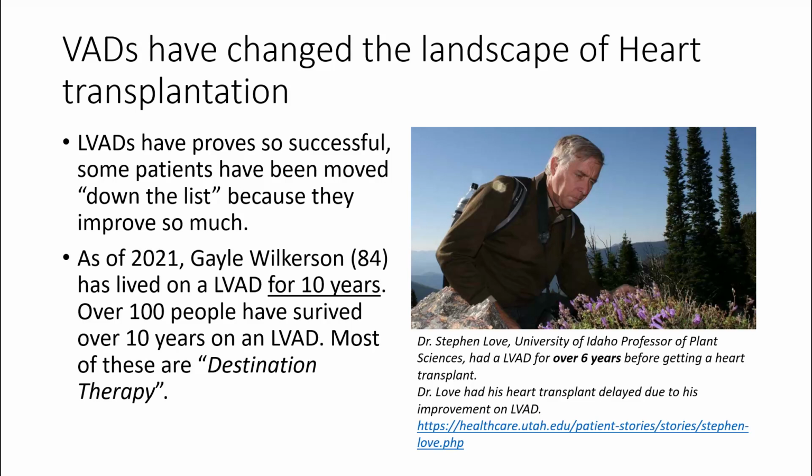As I said, some of these patients can live on an LVAD for over 10 years. Generally, so far there's been over 100 people, which is a small percentage compared to, I want to say there's 60 or 70,000 of these devices placed in the United States, and more every year. But still, some people live quite a long period of time. There's a lady here in Idaho, I don't know if she's still alive, here in Boise, who had just had her second LVAD and went dancing every day. She outlived her husband on the LVAD.